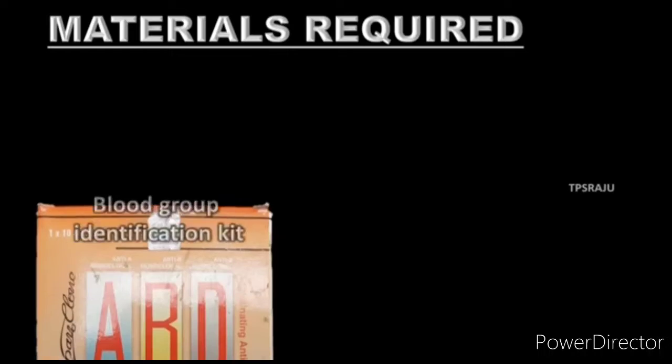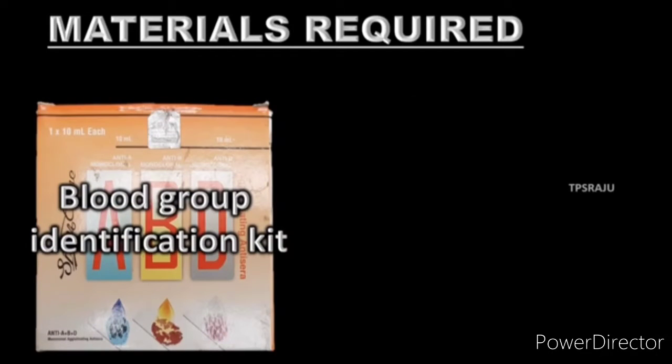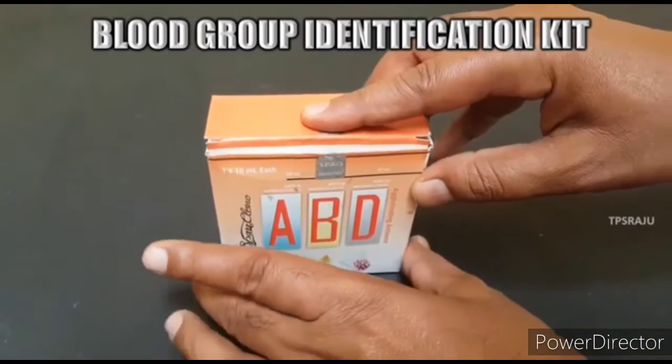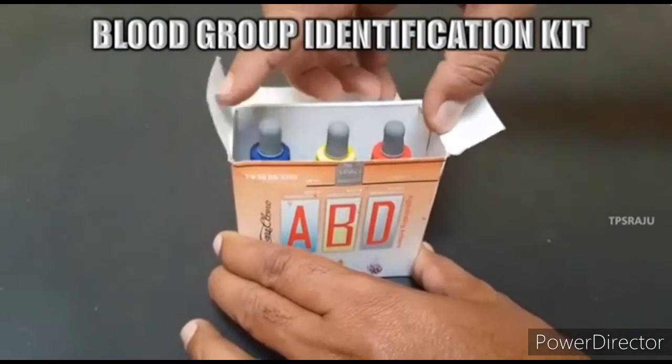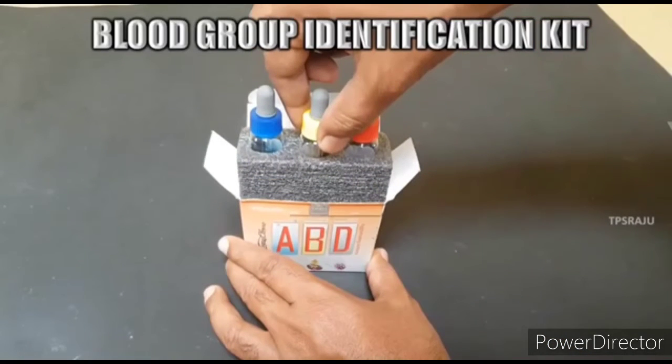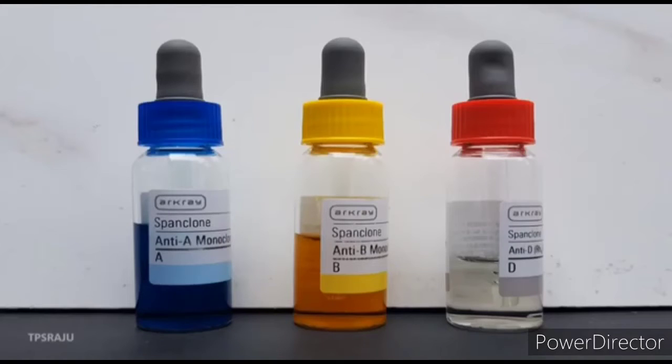The material required for identification of blood groups is very simple. We need a blood group identification kit, glass slide, alcohol or spirit, needles and cotton. The blood group identification kit contains 3 small bottles. Those are blue, yellow and transparent in color. These are respectively anti-A, anti-B and anti-D serums.